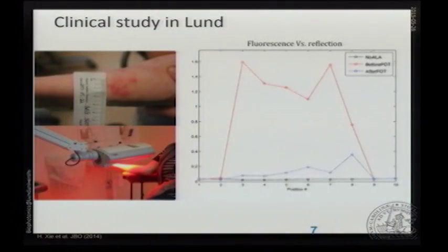This would just be an assessment of fluorophore concentration. After the PDT, we have bleached away most of it, and before providing any ALA, we have absolutely nothing, obviously. So that seems to work fairly well.